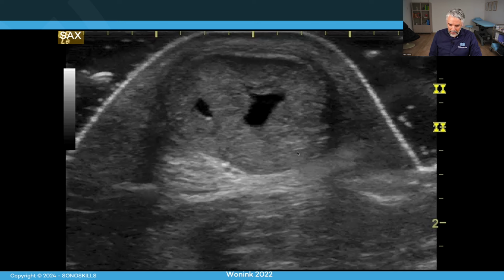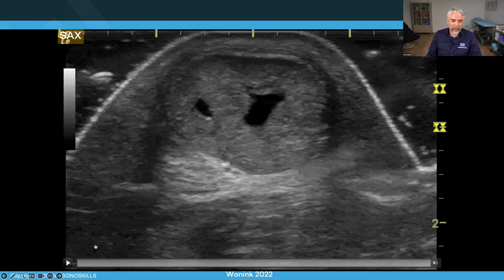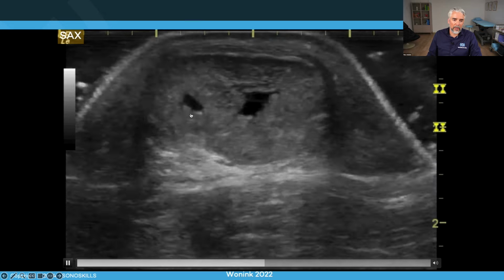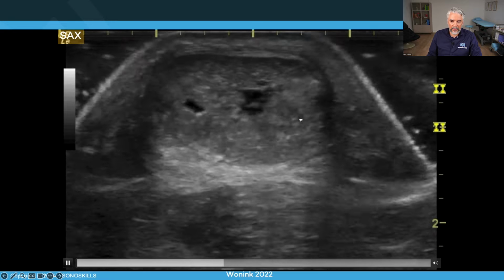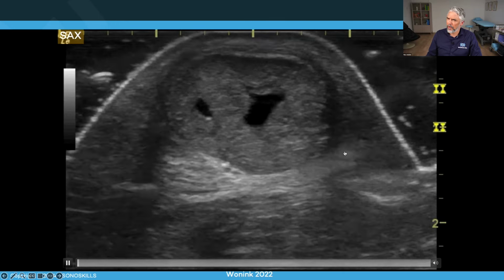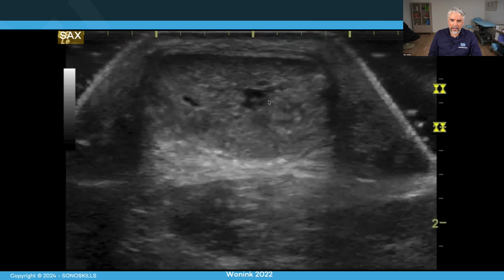A sign of tearing can be seen in this case. We can see an oval, almost roundish Achilles tendon. This Achilles tendon is swollen and shows a large partial tear right there. This partial tear is also compressible. It's not only here, but also at this level. And then we can see softening of the tendon. And this makes also that the tendon is really compressible. So we can see a large, very severe tendinopathy and a large partial tearing inside the central tendon.